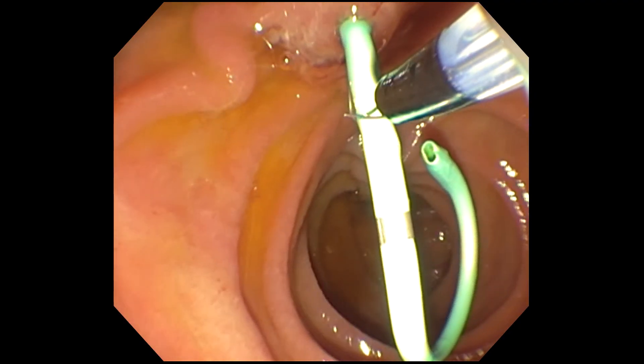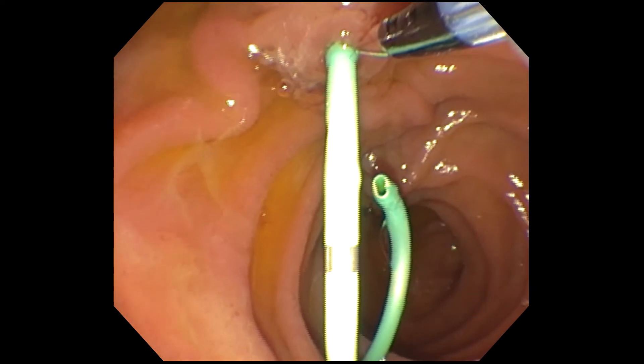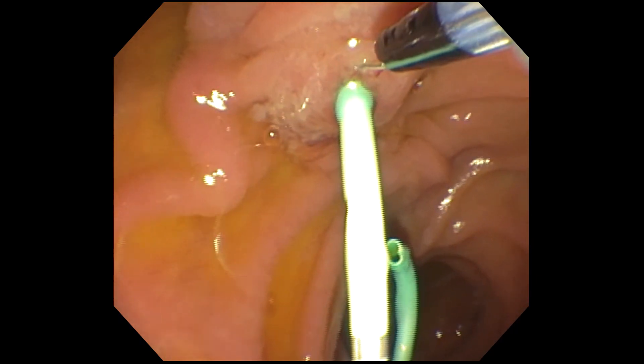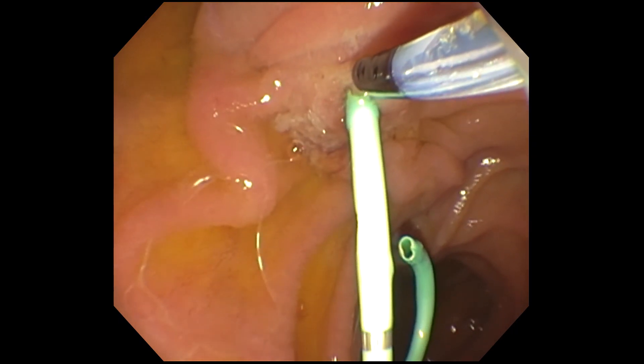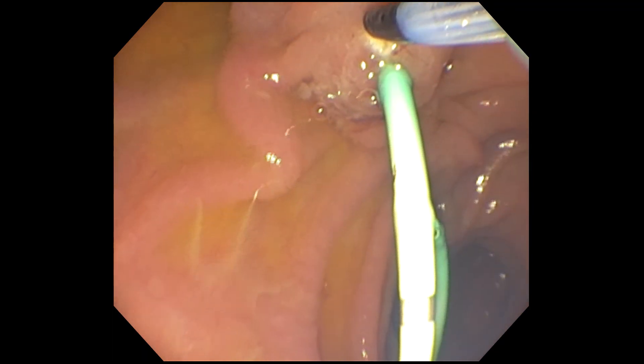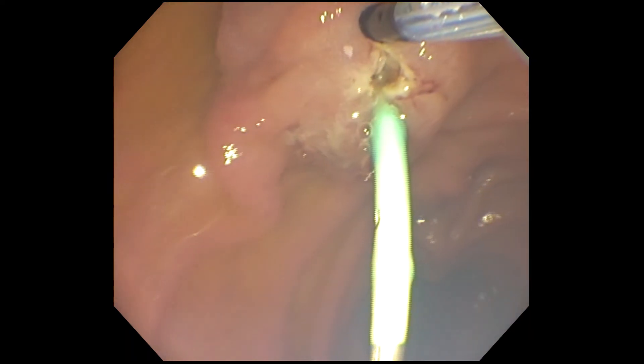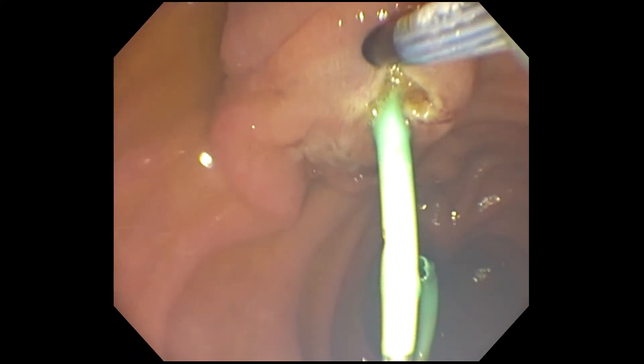Learning needle knife sphincterotomy can be hard and takes experience. Those lucky enough to train in an advanced endoscopy fellowship will hopefully have some exposure to it. Needle knife sphincterotomy is achieved with a special device called a needle knife sphincterotome — very similar to a bowing sphincterotome except it has a small electrified needle that comes out. It can be done freehand with no pancreatic stent in place, or after pancreatic stent placement.